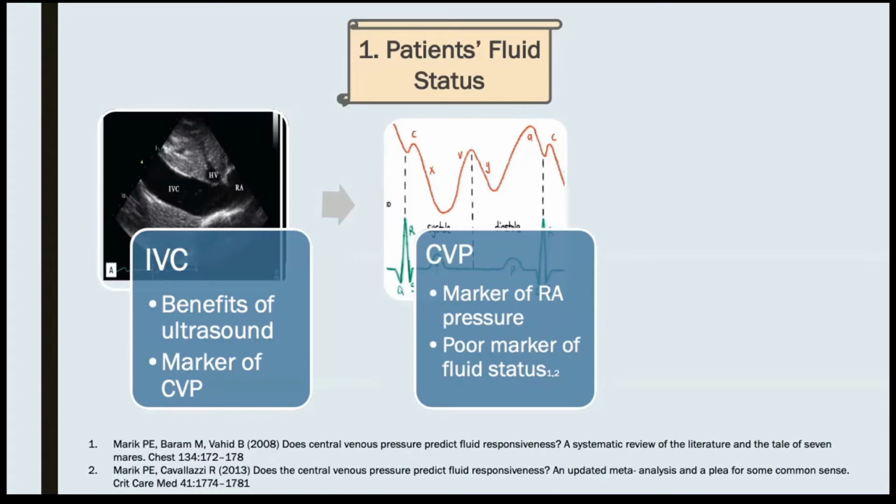So what if you are normovolemic, but you've got endogenous catecholamines going, and your heart's just managing? What if your heart is just strong at that moment and it looks empty because everything that's going to it is working? Do you not give fluid? What if you are fluid behind, you've got acute cor pulmonale, you've got septic cardiomyopathy, and your heart's not doing well? So all that it means is push back, and it doesn't mean anything about the fluid status.